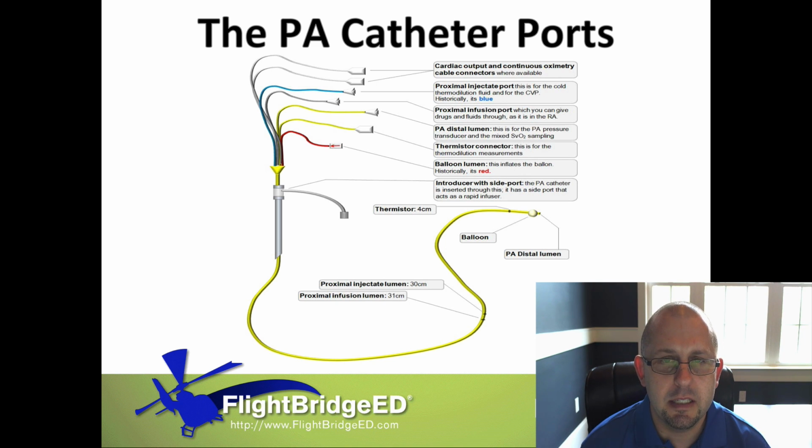You had to be very consistent, and each syringe that you use, as you may know, may have a different friction based on the plunger. They don't all work the same. So there's a lot of things that could have hindered a proper cardiac output measurement.